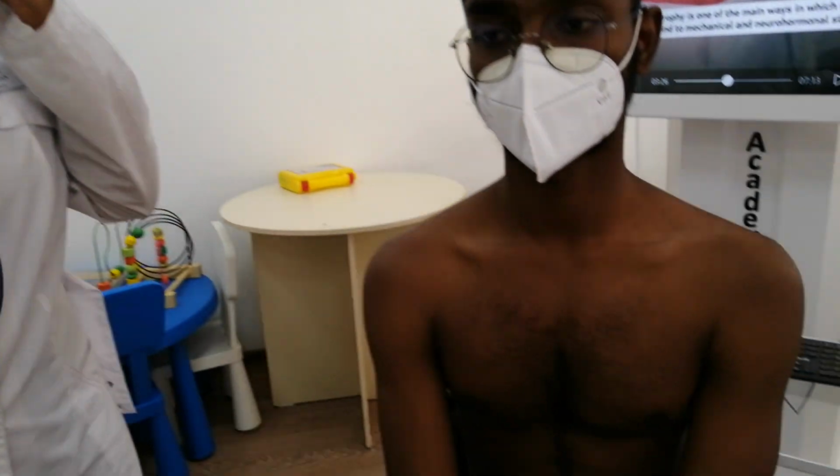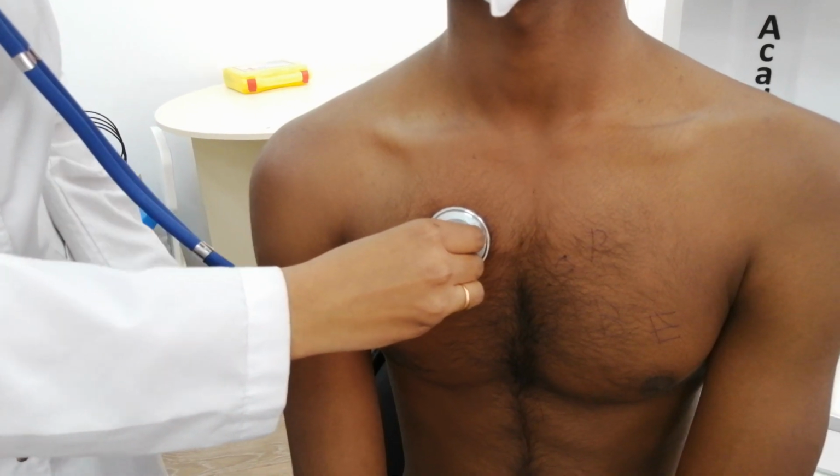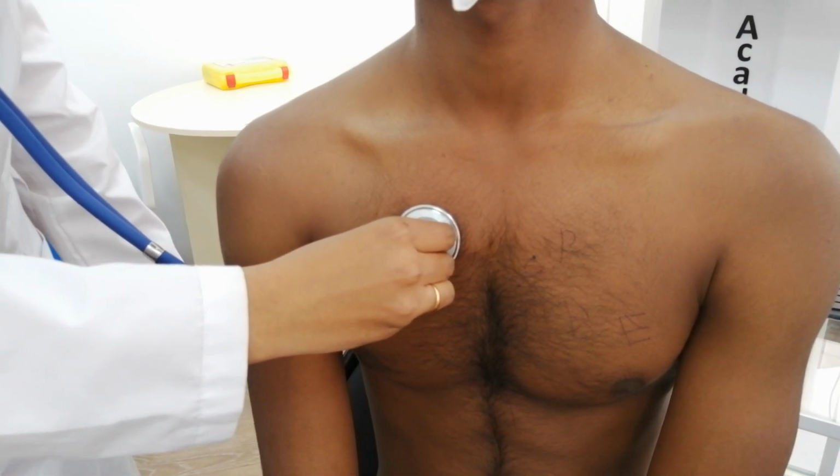Second is the aortic valve that is present in the second intercostal space on the right side. Okay. And the next one is the third one. It's the pulmonary valve which is present on the left side in the second intercostal space. Okay.